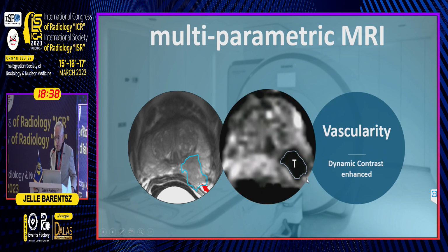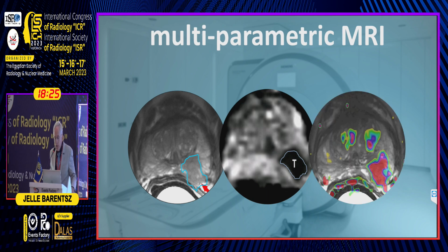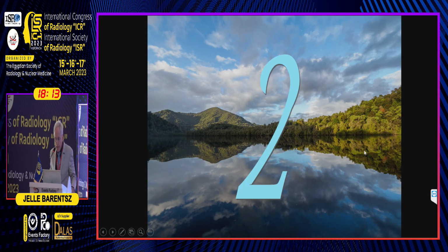With diffusion-weighted imaging on the ADC, a black hole means reduced velocity of water molecules, high cell density, and cancer, aggressive cancer. Finally, we have vascularity showing the vascularization, and both in inflammation, benign prostatic hyperplasia, and cancer, this is increased. So we use them together.